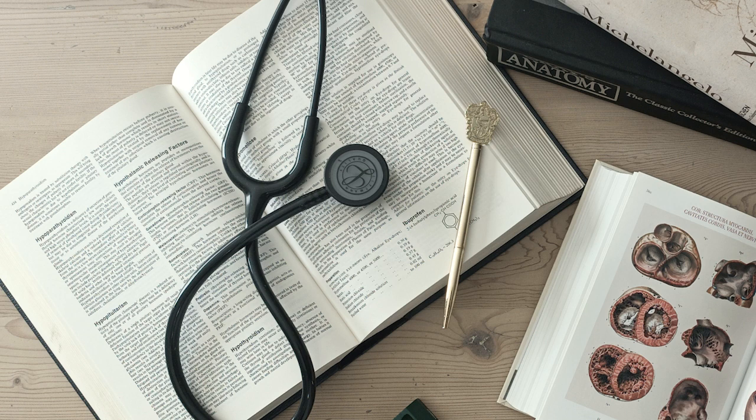This systematic approach, P, PR, QRS, will guide you consistently and effectively, streamlining your diagnostic process. Beyond just the ECG strip, understanding the clinical relevance of arrhythmias and assessing the patient's pulse are equally vital. In fact, you said feeling the pulse is the first step. What kind of symptoms can these conditions produce for our patients? Right, arrhythmias, whether they manifest as brady or tachyarrhythmias, share many common clinical symptoms, which can sometimes make initial differentiation tricky based on symptoms alone.